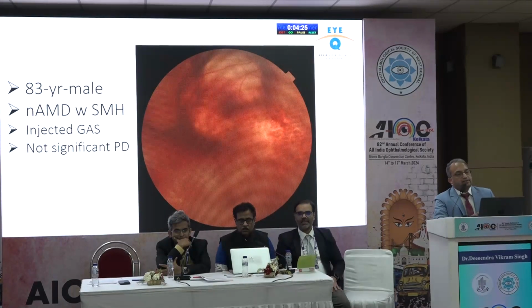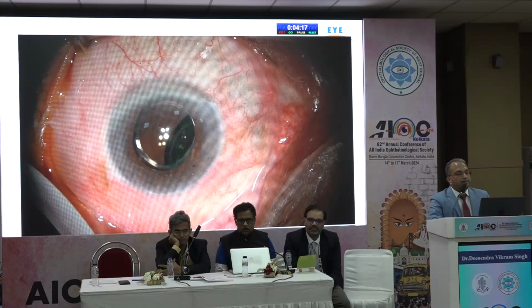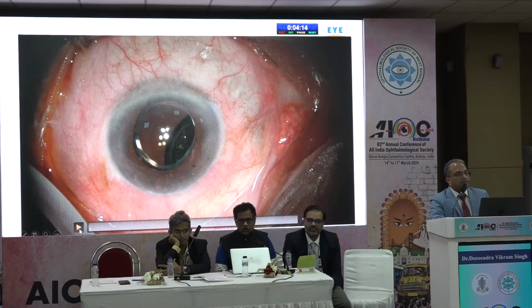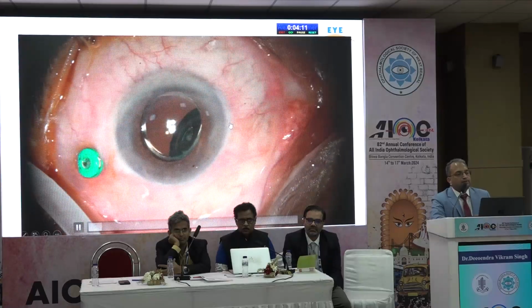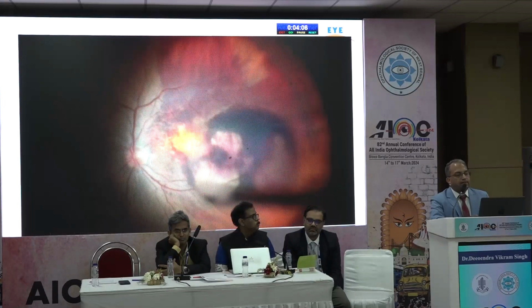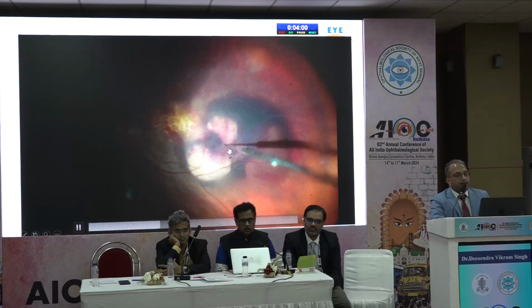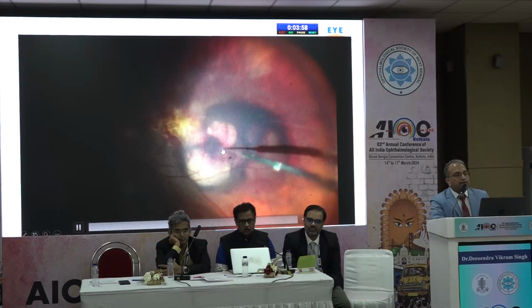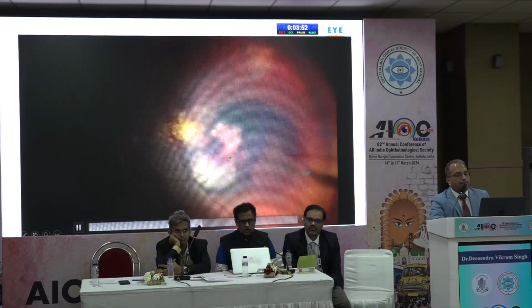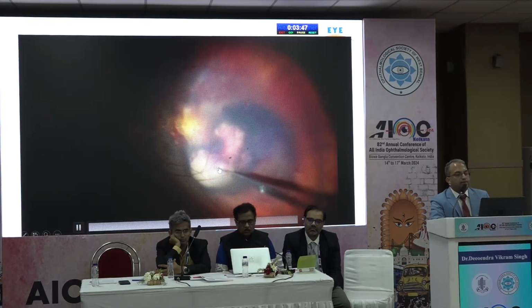Another patient having this submacular hemorrhage and some breakthrough hemorrhage also. We again, as a rule, tried intravitreal gas, but it didn't work much. And this is the point I was highlighting in the first talk, that if you have to plan a subsequent intervention, your first aid intravitreal gas doesn't interfere with that. Now, you see, this patient has a hemorrhagic PED here, and I'm going just at the edge of the PED, and my interest is to displace this central blood, and you can see the bleb.